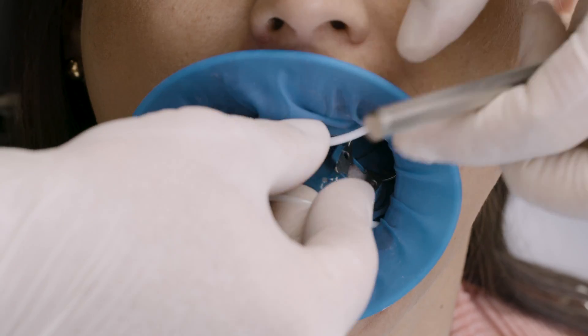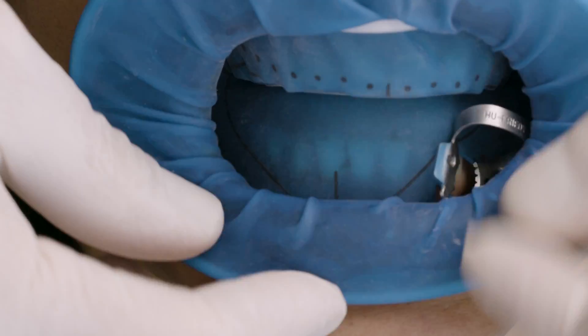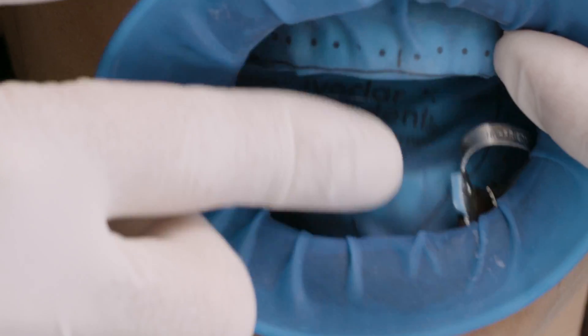Place Optradam first in one corner of the mouth and then in the opposite one. Subsequently, position the dam behind the lower and upper lips. Having the patient close his or her mouth aids placement of the dam.